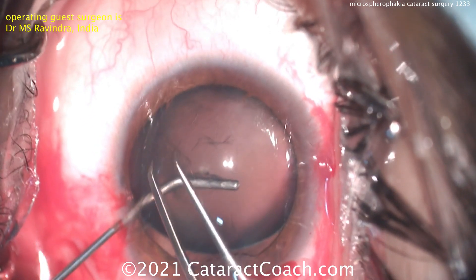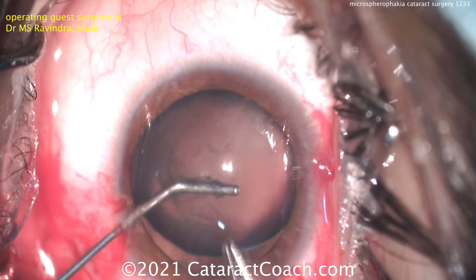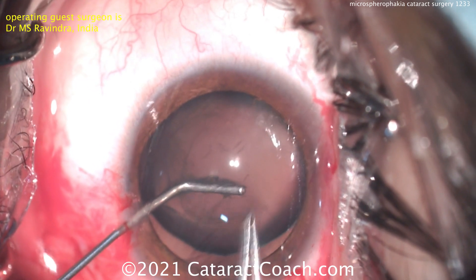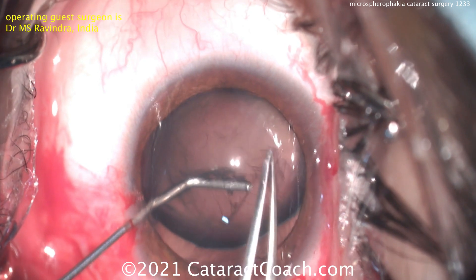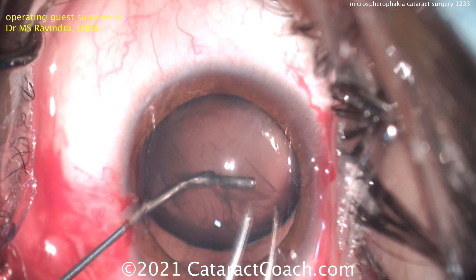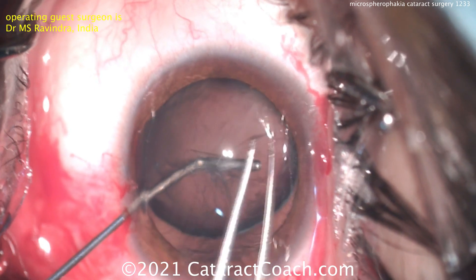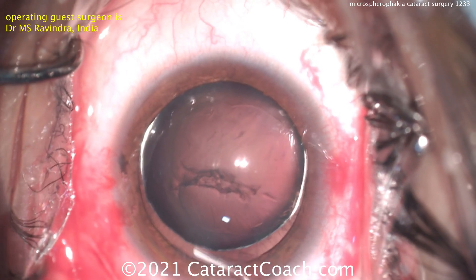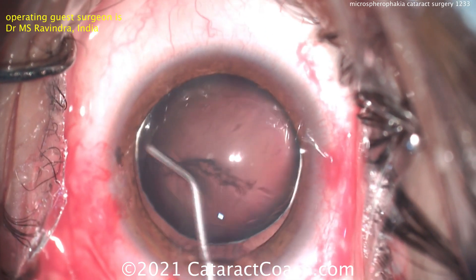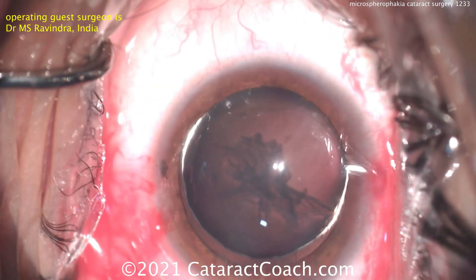So you want to make that 5mm capsulorrhexis, as we're doing right here, which looks great. But keep in mind that 5mm capsulorrhexis may seem very large in comparison to the lens diameter. There's a little bit of run-out here of the rhexis — bringing that back in, getting this completed. This is not easy, because the anterior surface of the lens capsule is also highly curved.